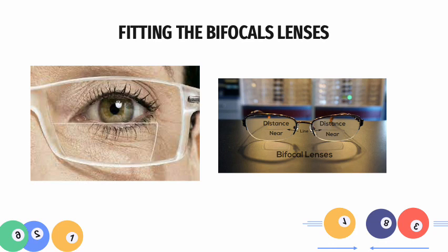How do we fit bifocal lenses? Is it the same as single vision glasses? Where should we locate the segment so that they will see through the segment during near work? Which segment type and size do we need to choose best for the patient? For the next section, I will explain the fitting of bifocal lenses. Whatever it is, the aim in a bifocal lens is to provide equal clarity for both distance and near.